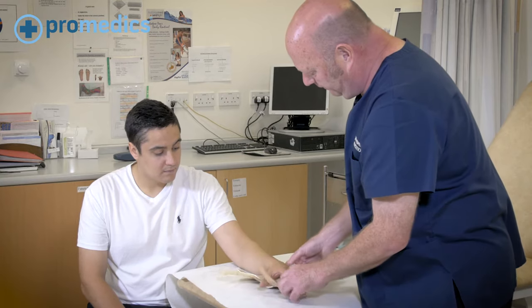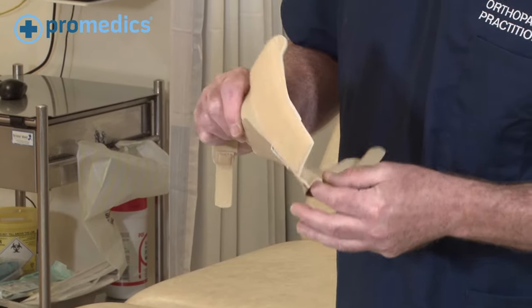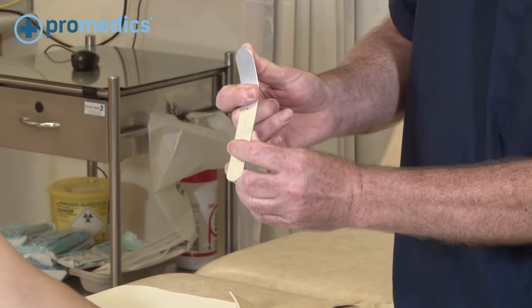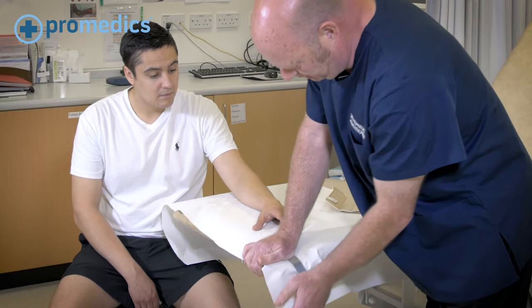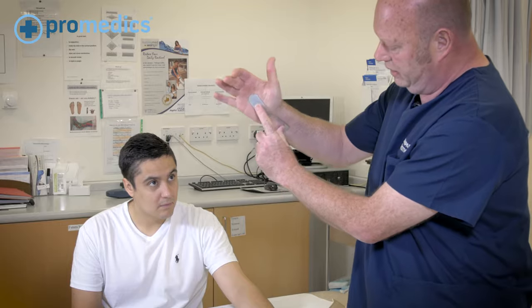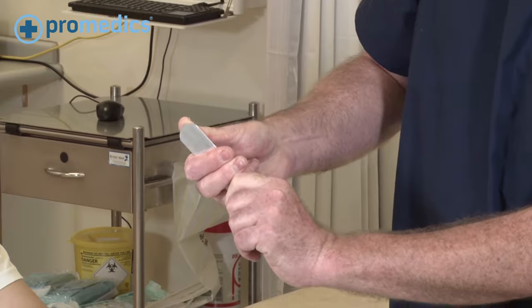These braces have a metal bar — a little aluminium bar inside — that you can adjust very simply, even by bending it over the table, to adjust the angle as it would be sitting in your wrist, or if you didn't want it quite as much as that.